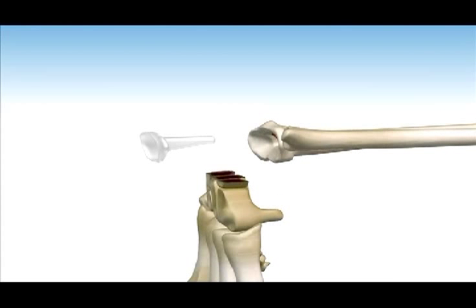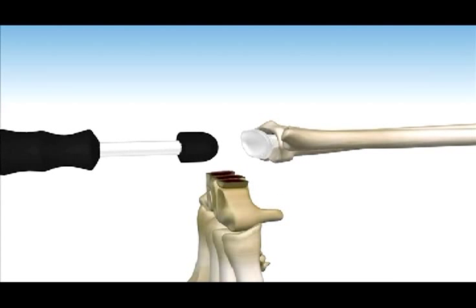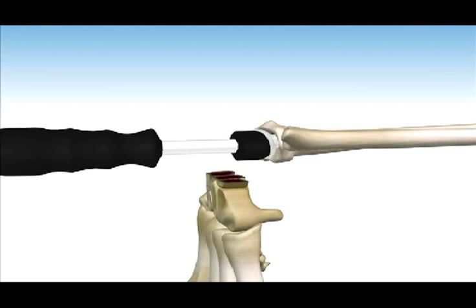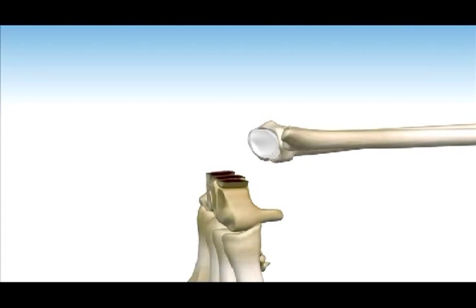Insert the radial trial into the prepared canal and impact the trial until seated. Evaluate the fit of the component against the scaphoid and lunate fossa as well as the dorsal peripheral ridge. The implant should fit snug or flush against the dorsal ridge of the distal radius. If the fit is satisfactory, remove the trial component by engaging the extraction holes with a galpy retractor. If the trial is proud, further broaching or selective burring of the distal radius is needed.